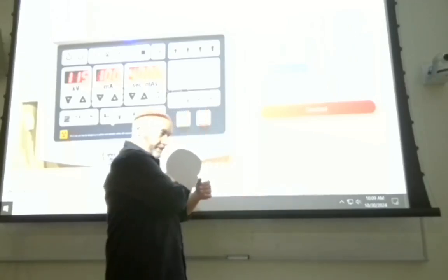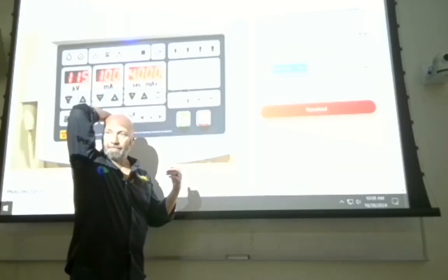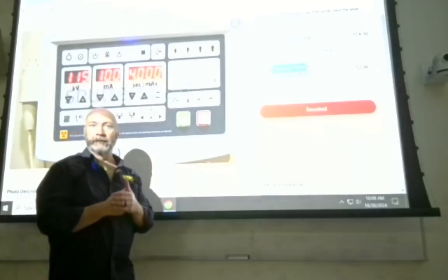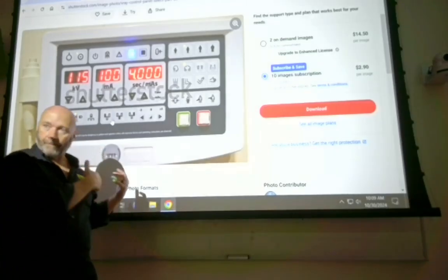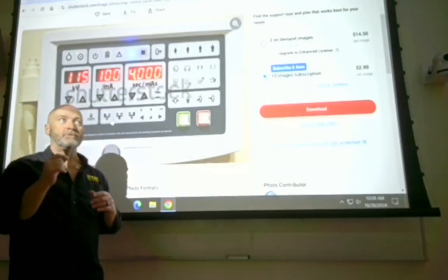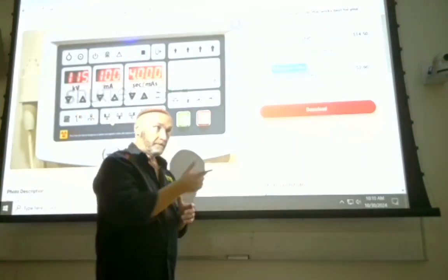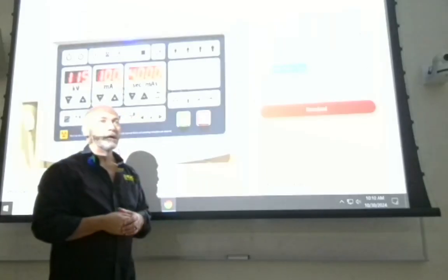Positioning wise, we put the anatomy of interest closest to the image receptor. We elevated the side that we didn't want to see. But what did we do with our technique? Okay, we had to go up, right, from a shoulder technique. But what did we want to not see prominently in our X-ray?